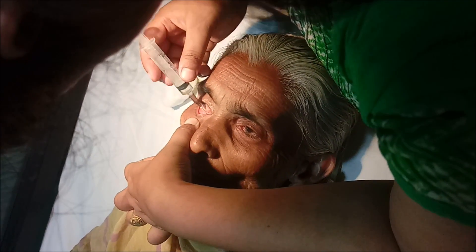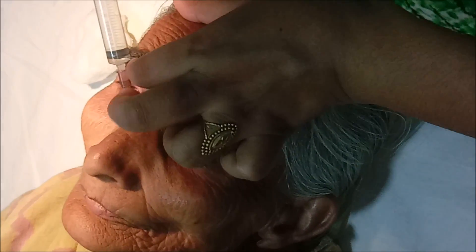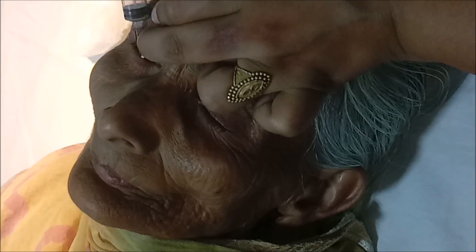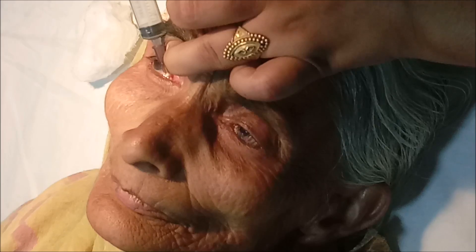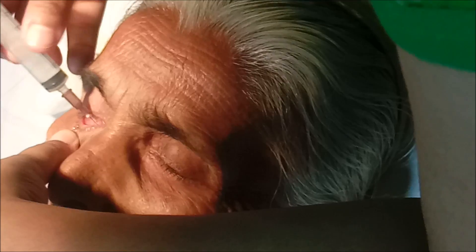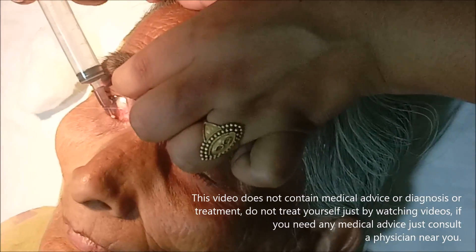If the fluid goes without leaking, we ask the patient whether it has gone into the throat — that means patency of the nasolacrimal duct is present. If the fluid comes back out, as you can see in this patient, that means there is an obstruction in the nasolacrimal duct.